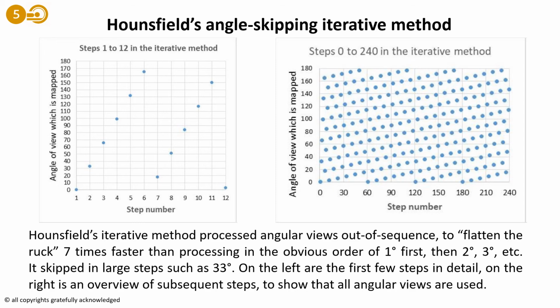And you could look at that graph and say, well, wait a minute, you've left gaps in between and you haven't used those. But then you go round again at a slightly different angle, but still with steps of 33 degrees and so on. And if you look at the graph on the right, it shows that as you do more and more steps, you fill in all the gaps.